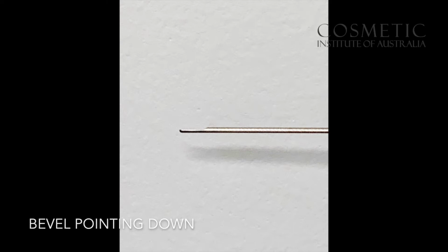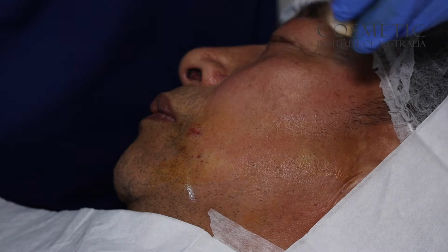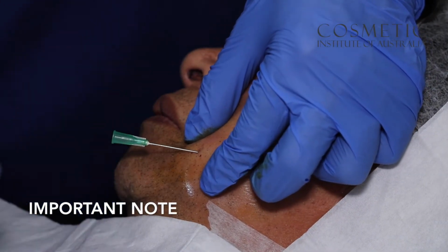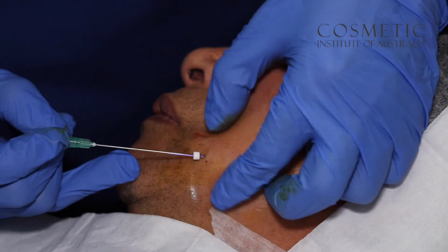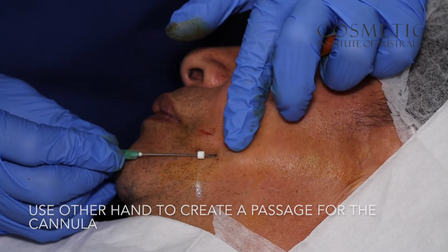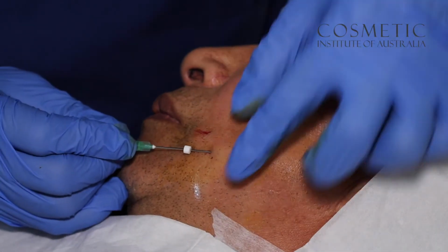Now moving on to thread insertion. Firstly, insert the trocar. Next, insert the cannula with the bevel pointed downward. Push the cannula along a tunnel created by the assisting hand. Always remember to push the cannula away from the body and not towards the body for safety.